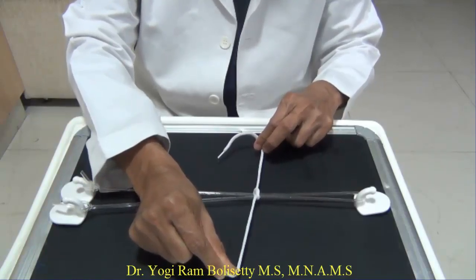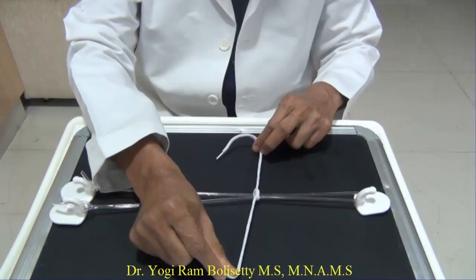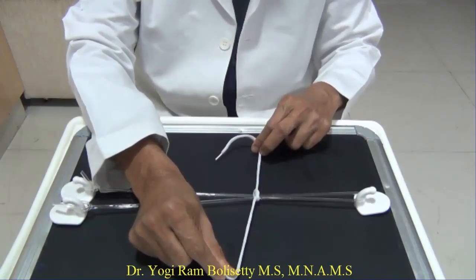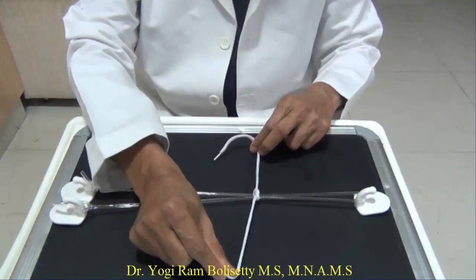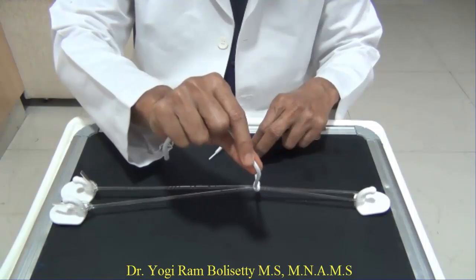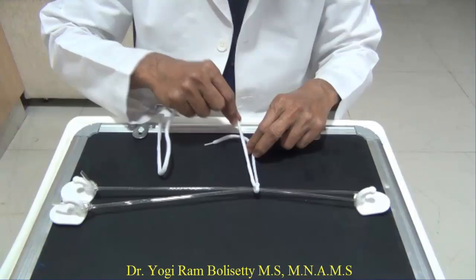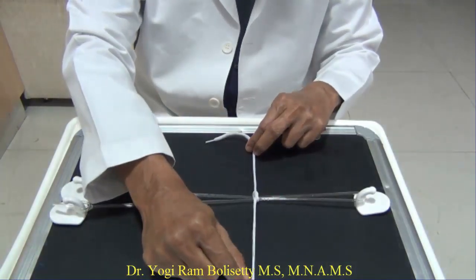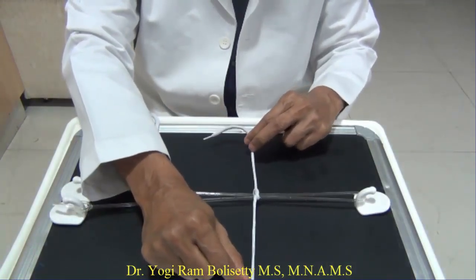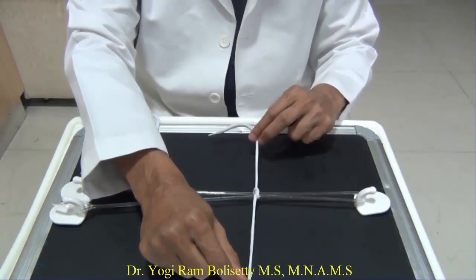Please observe, the 2 strands are pulled against each other in exactly 180 degrees. If you form the throw like this, it will be a secure throw. If you alter the direction and pull it, then you will get an insecure throw. This is an insecure throw. This is a secure throw. Keeping the tension on the throw like this, now you have to form the second throw.